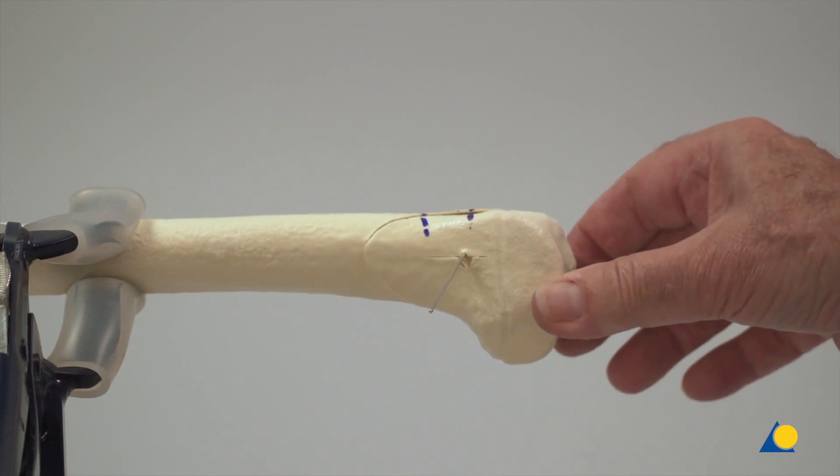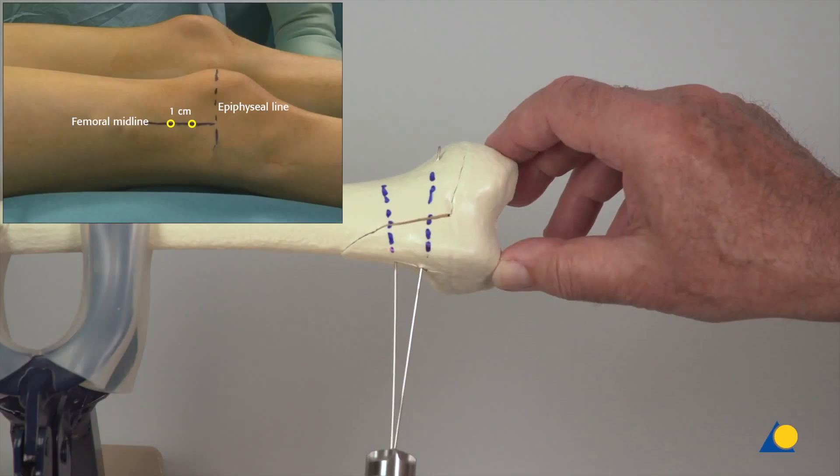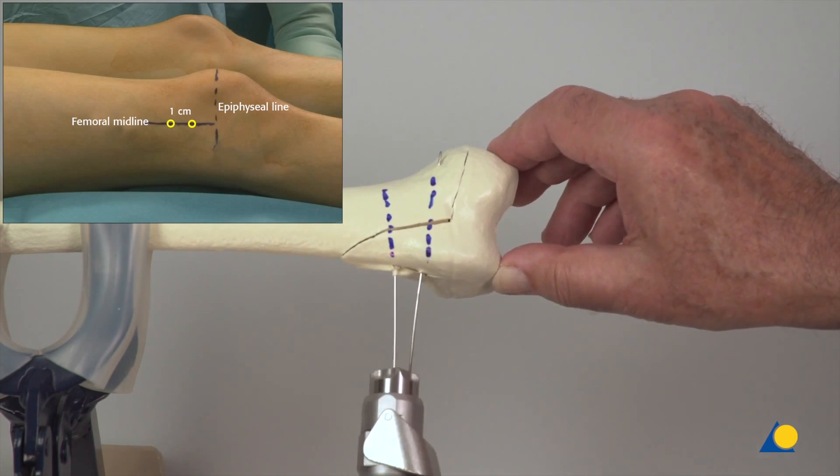The second wire is inserted approximately 1cm proximal to the first, perpendicular to the fracture plane.